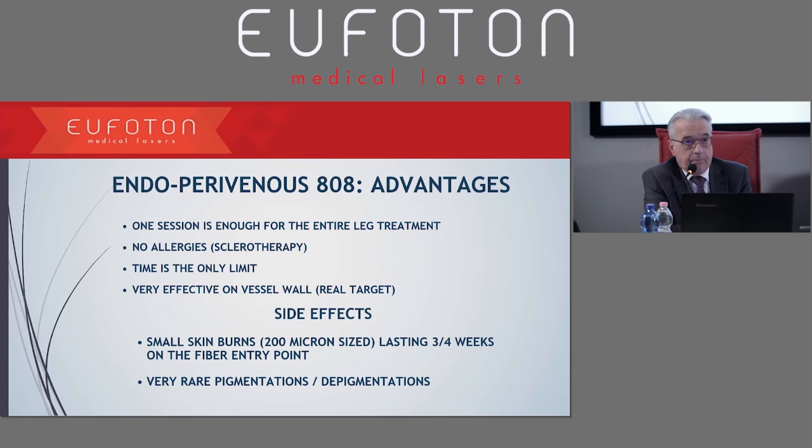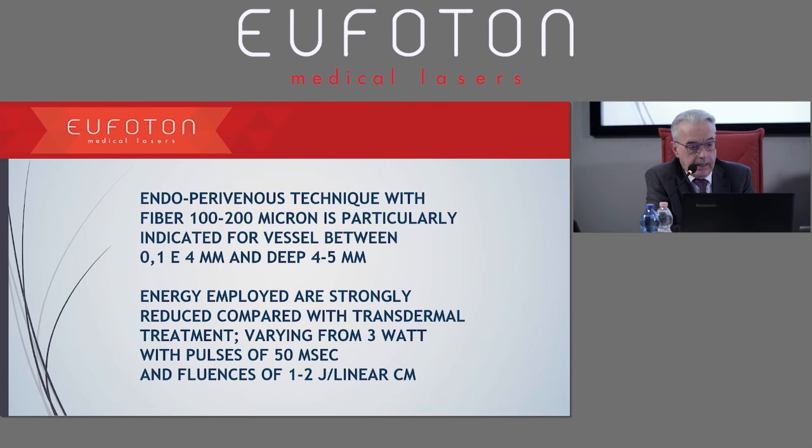We found a way to reduce this time frame for those irritation little dots so that the patient is not worried about those. Pigmentations and depigmentations are really rare, even if we use nude fiber with the right type of energy through the epidermis. So rare pigmentations, hyper and depigmentation, that's what I said.